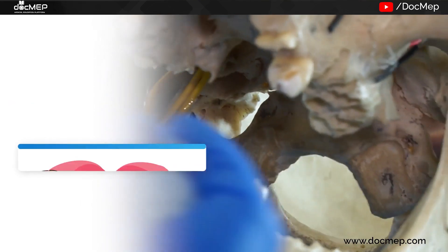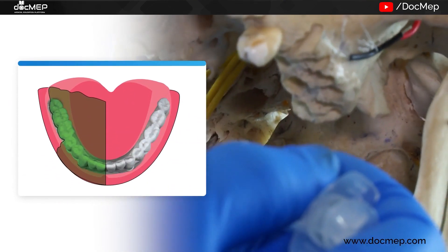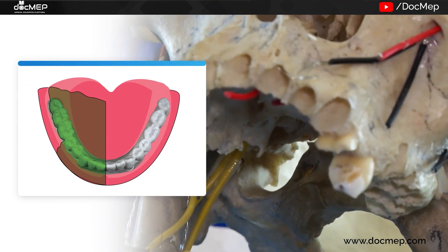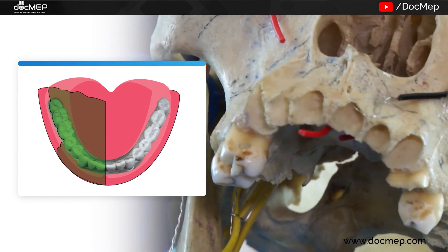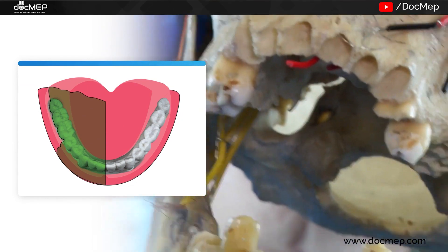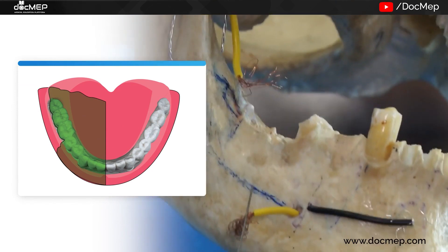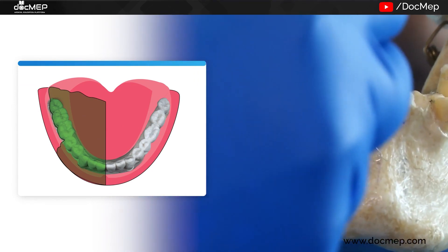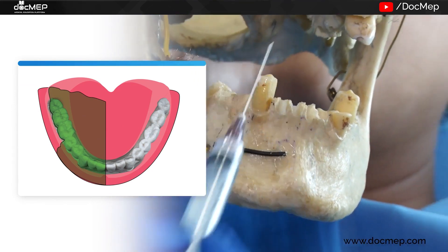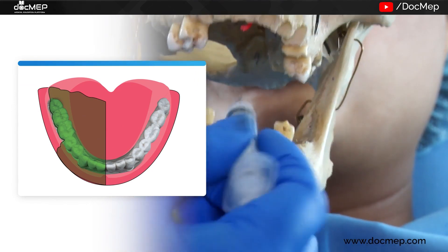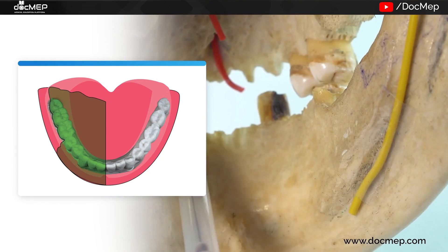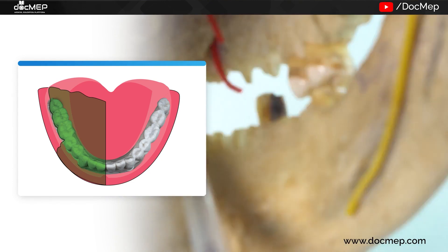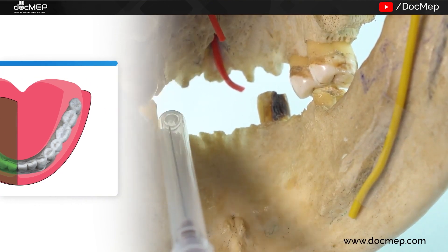The areas anesthetized are the mandibular teeth till the midline, the body of the mandible, the buccal mucoperiosteum, the anterior two-thirds of the tongue, the floor of the oral cavity, the lingual soft tissues, and the adjoining gingiva.